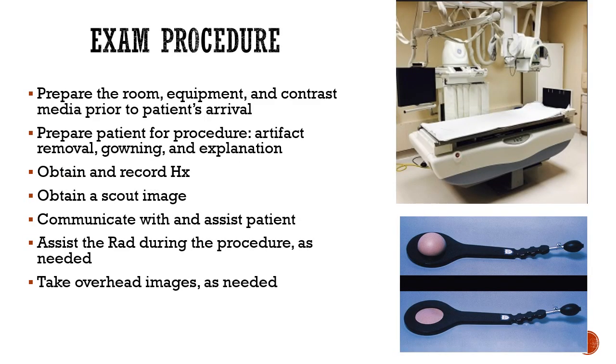So when to prepare the room, the equipment, and the contrast prior to the patient's arrival, prepare the patient for the procedure, in all cases, artifact removal, gowning, and explanation, obtain and record the patient history, obtain a scout image if that's the protocol for the facility, communicate with and assist the patient, assist the radiologist during the procedures needed, and take overhead images as required.